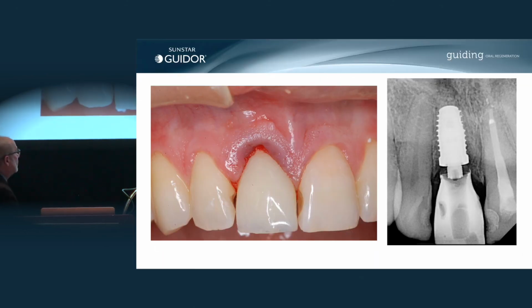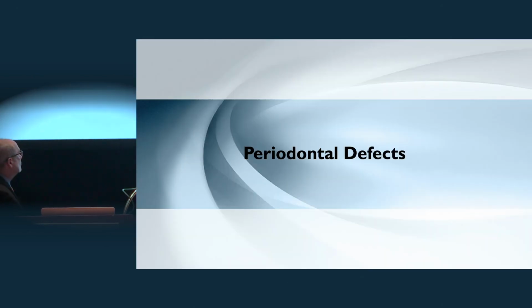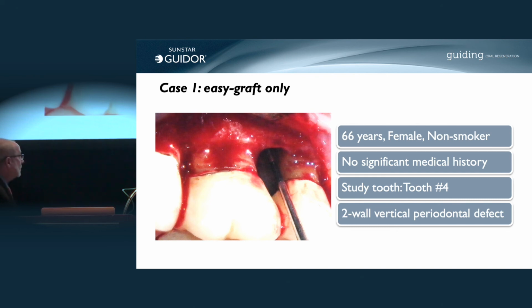I've used it in several patients on periodontal defects. This is one of the patients. This is measured in 3 millimeter increments. This is about 9 millimeters right here. The patient is a 66-year-old female, non-smoker, no significant medical history. Distal of tooth number 4, most of the bone was present. There is a vertical periodontal defect.